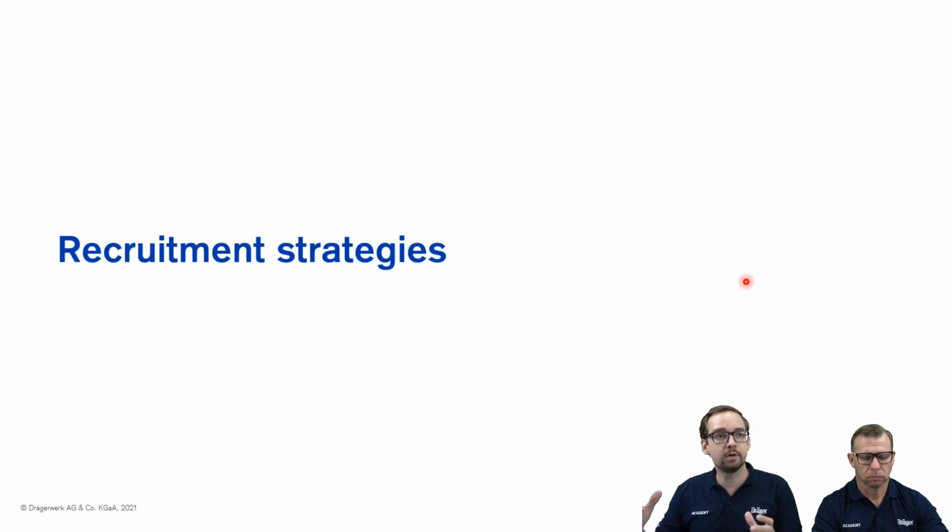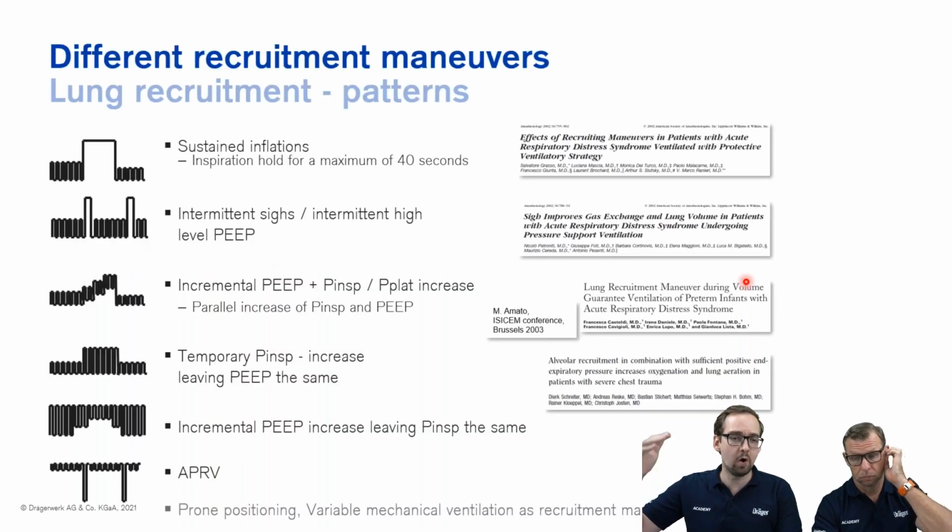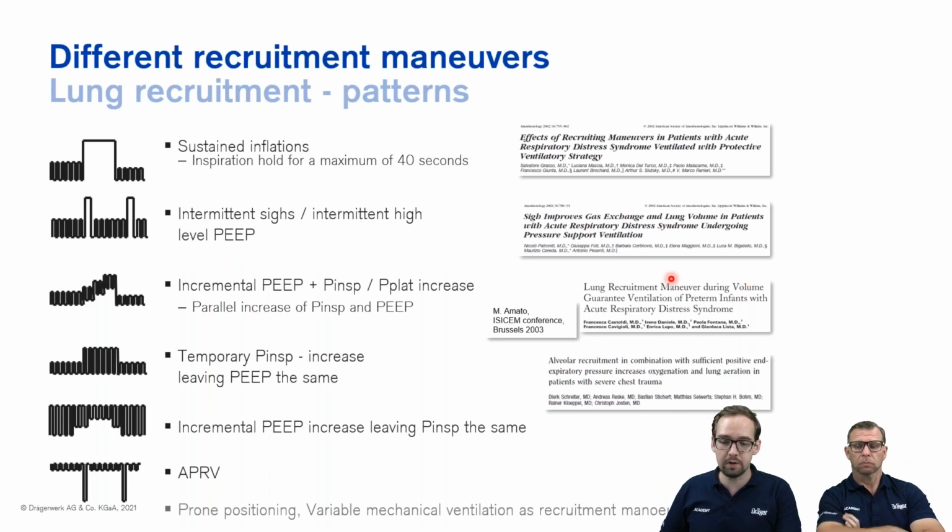So we talked about already, let's say, the landscape. We talked about the open lung concept. Now let's really dive a little deeper. How can we do lung recruitment with our ventilators? And here you can see a big overview of all the different strategies.